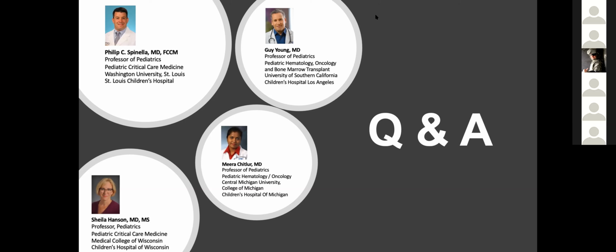I agree with Mira's last point, and we do the same thing. We actually measure all of them and try to look at them in aggregate and come up with an approach, but you still need to have a primary assay that you often titrate your medications on, especially when you have a whole group of people that you're trying to get to follow a certain approach. So Guy, I'll start with you. For heparin infusion anticoagulation titration, what assay do you use and why?